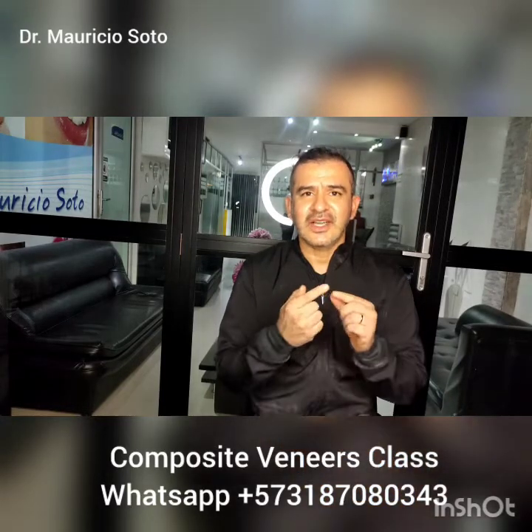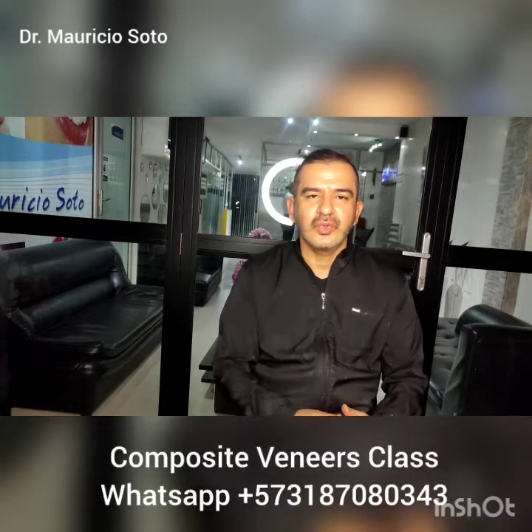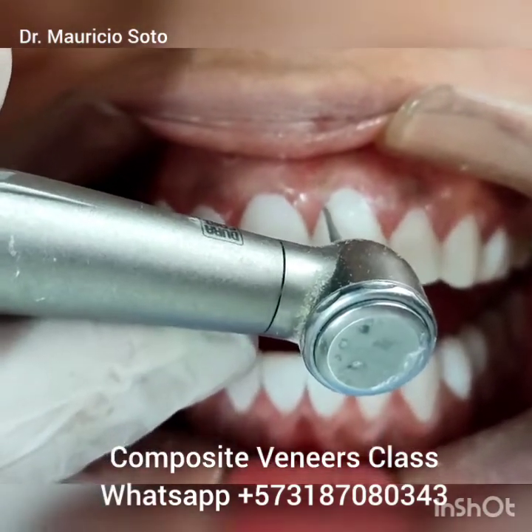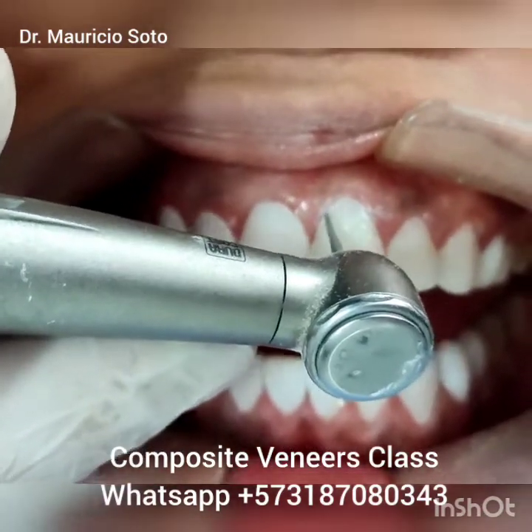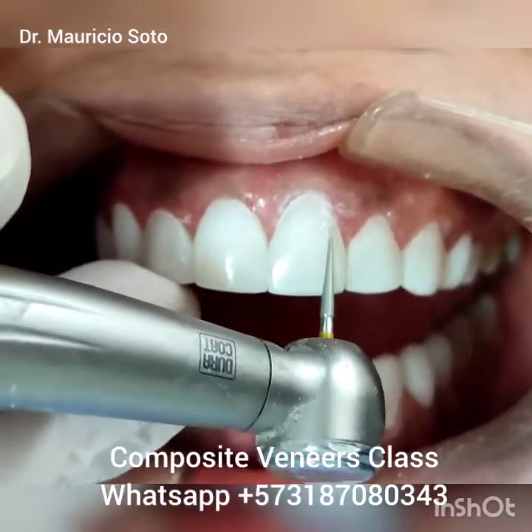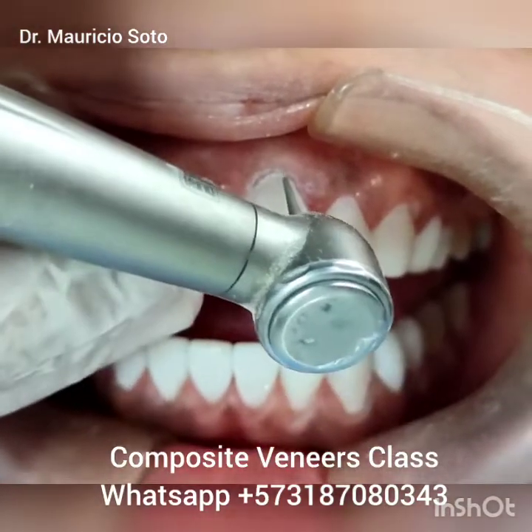I use a very, very sharp, very, very thin high-speed conic bur for doing this — a very, very thin high-speed bur to remove the excess of composite around the gum. Remember that the composite near to the gum should be very, very thin to avoid the development of inflammation of the gums.